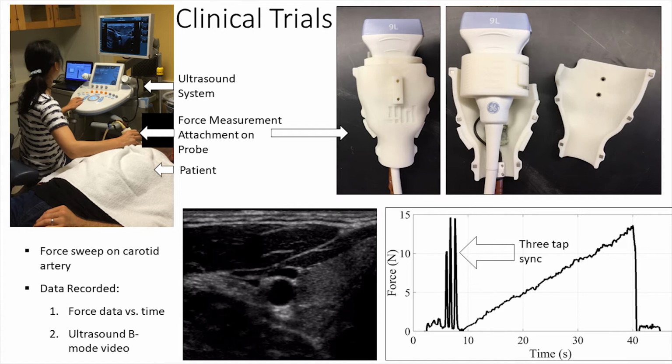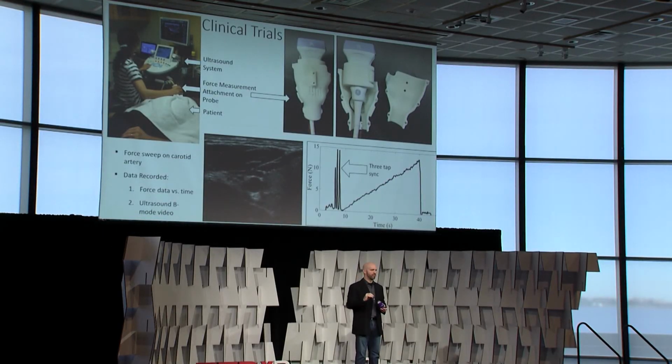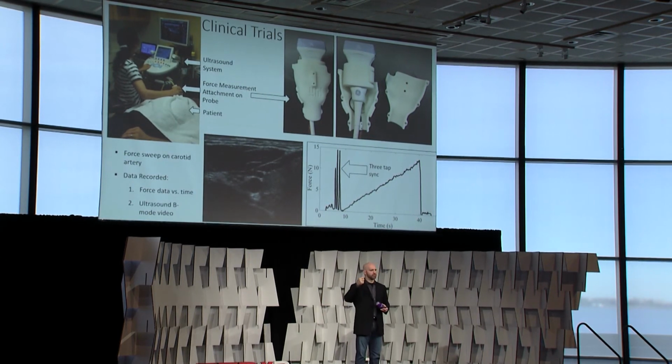Okay, so this is what we do. To try to answer this question, we started collecting a bunch of data at Mass General Hospital in a couple of clinical trials. We used a commercially available ultrasound probe, and on the outside of this probe, we mounted a force sensor that measures how hard we're pressing the probe against the body. We use that to acquire really two pieces of data. The video is the sequence of acquiring the ultrasound imagery across the carotid. You see the force being increased, and you see the pulsation of the carotid from the internal force. The plot on the bottom right is the force that we applied during the imaging process, how hard we pushed on the outside of the body as we're acquiring this imagery.